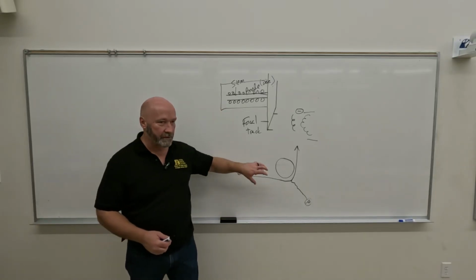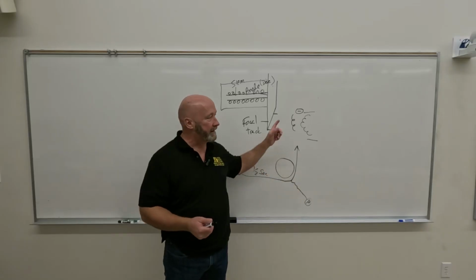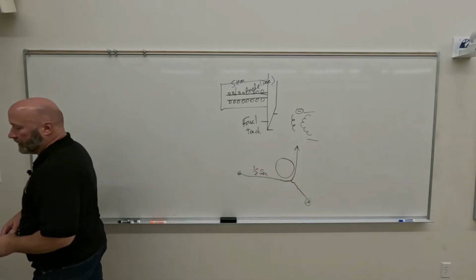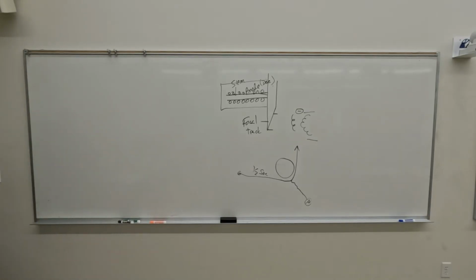So it's good for X-ray production. It doesn't melt, it doesn't warp, and it conducts well. Okay, so those are all the reasons for the tungsten.